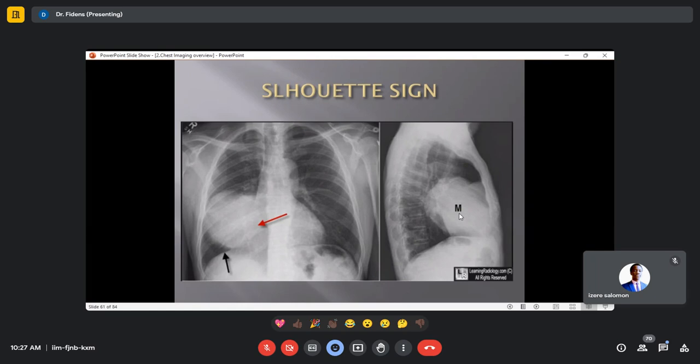I don't remember where. Who remembers? You are offside, guys. Tell me. Who remembers? I do. Air bronchogram is a pattern. Yes, it's Sirac.